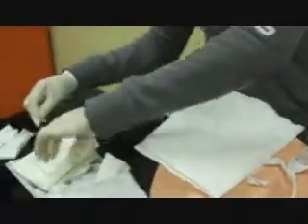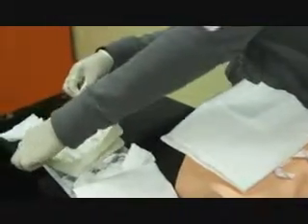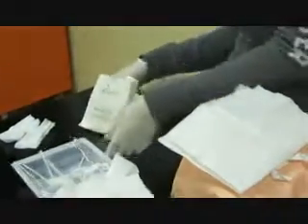Then we will take out our equipment as needed and lay this tissue across the patient's chest. Take out our gloves.